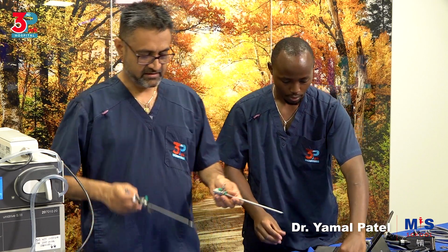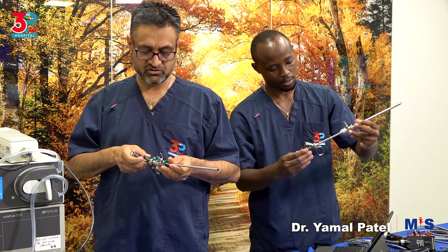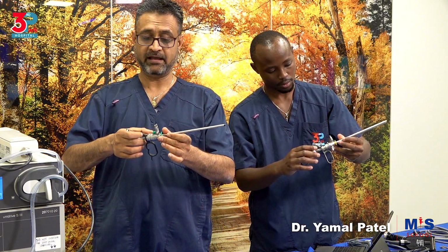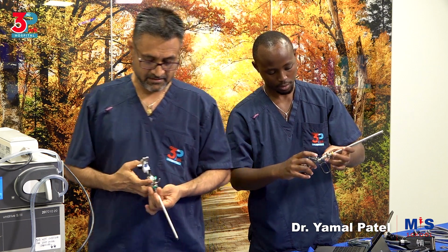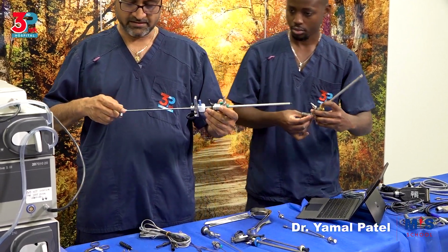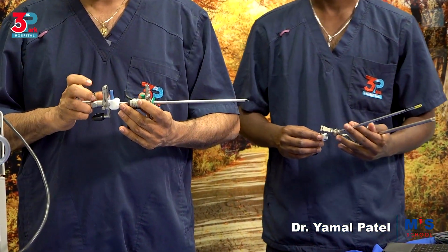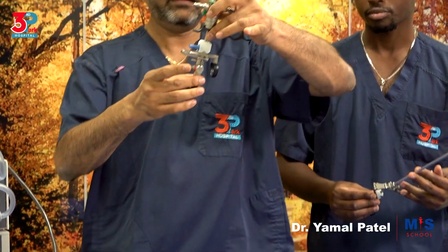Then you will take the working element and connect it to the scope and lock it. And the last part would now be the telescope that goes in and locks in. So this is a resectoscope connected.